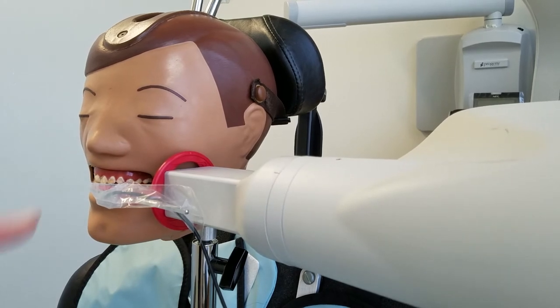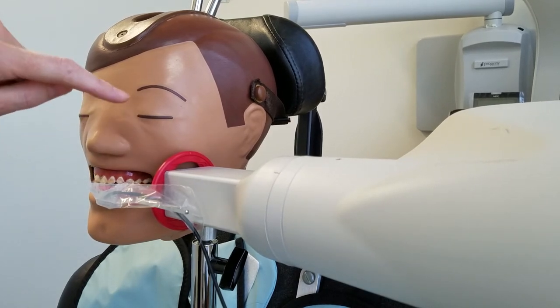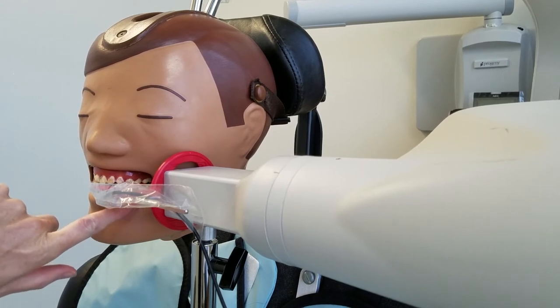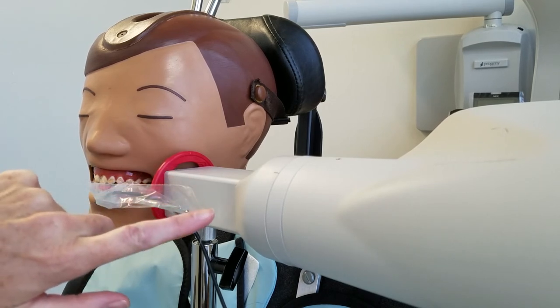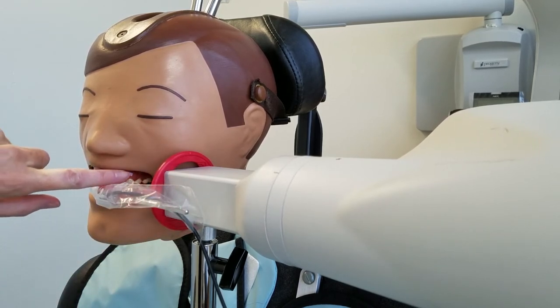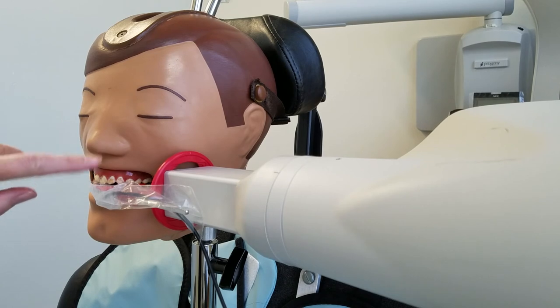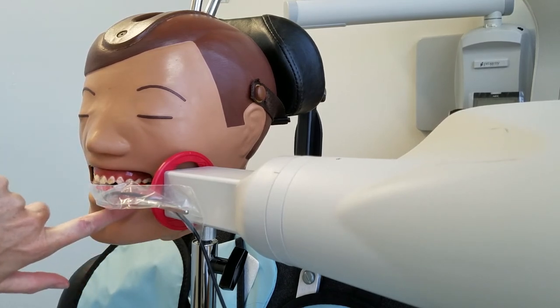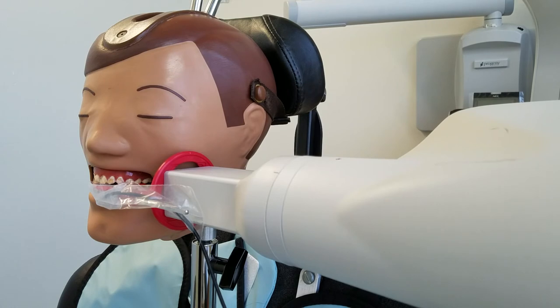I fussed with this a little bit off camera. If you rewind, you might notice that now the BID is much more centered with the maxillary and mandibular teeth — before it looked like it was almost down here. The moral of the story is that each manikin is very different, and when we're practicing we are going to have to kind of fuss with them a little bit.